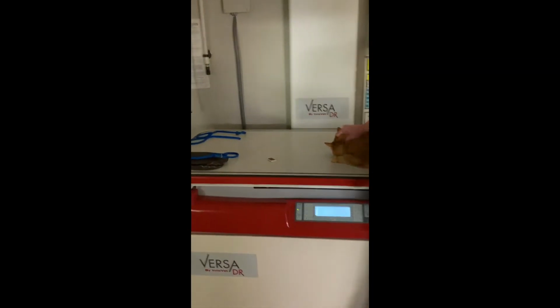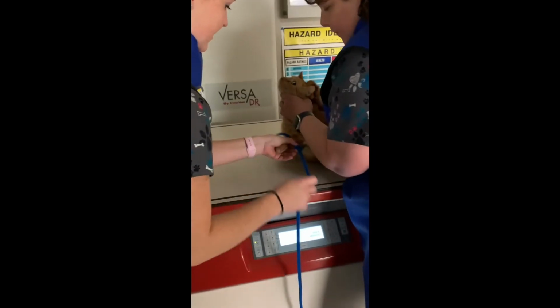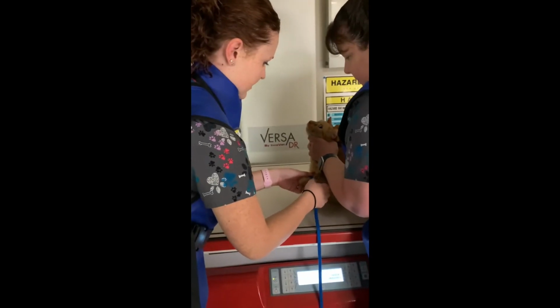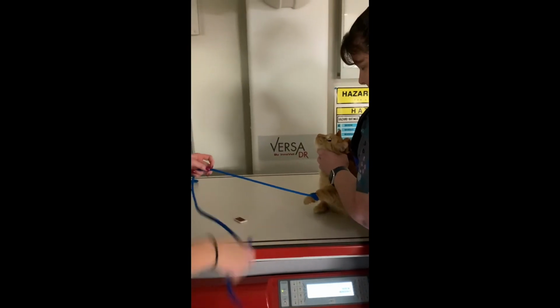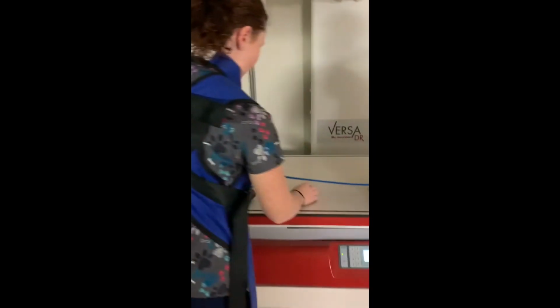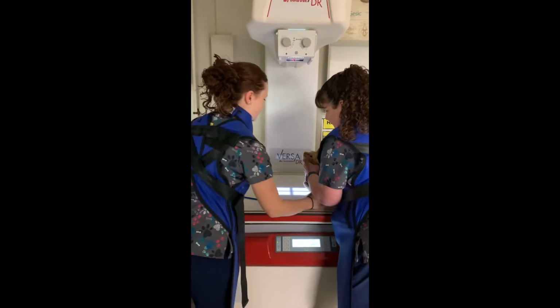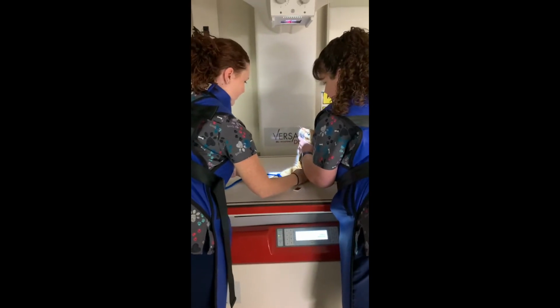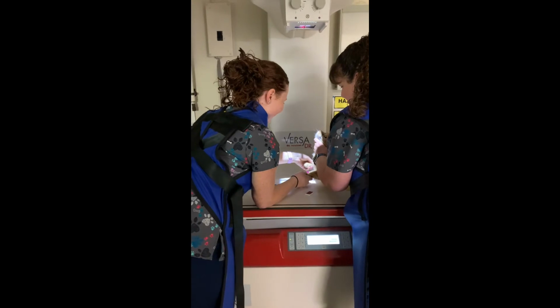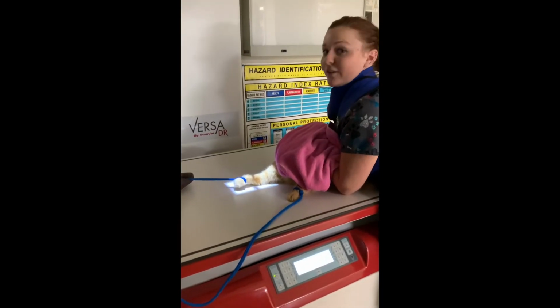Flip off the lights. I'm going to use a mechanical restraint of the surgical tie. Place that on so that way I can be as far out of the view as possible. Set up the right. We'll get him into position, so I'll have Brandy scoot him over, and she'll be holding his head out of the view. Okay, if you want to start.